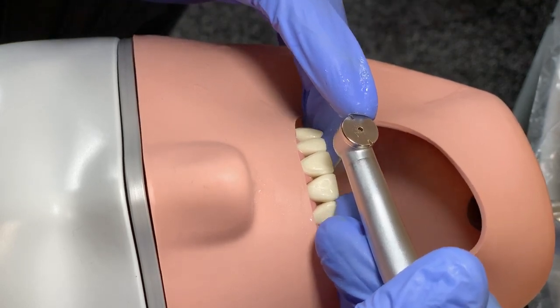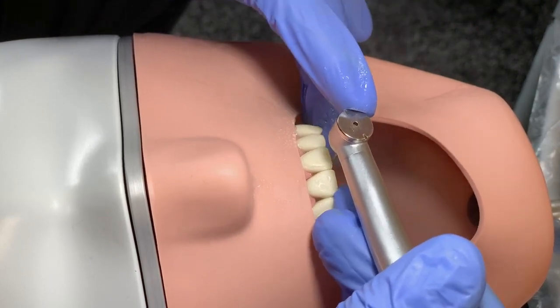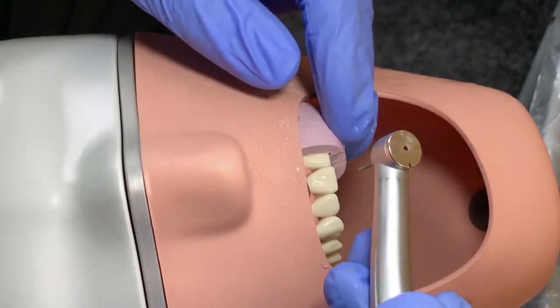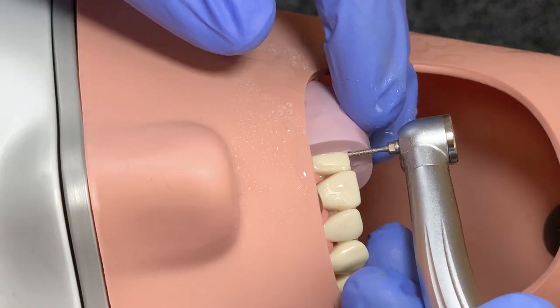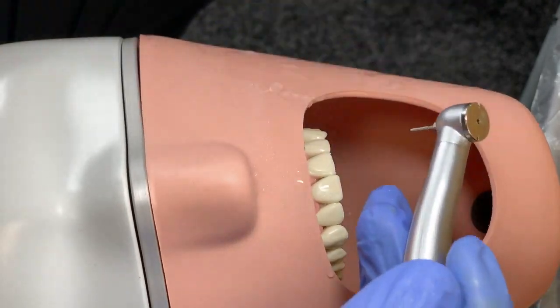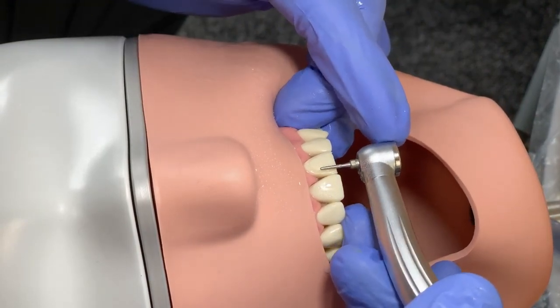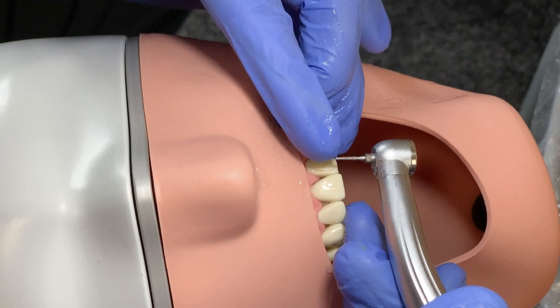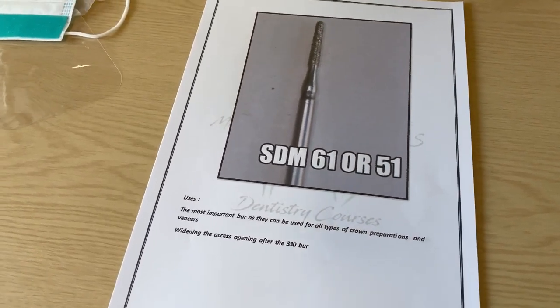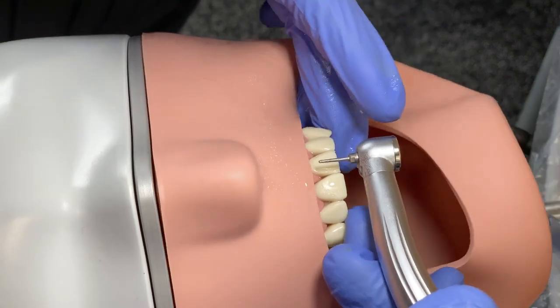This is how I hold my handpiece — this will help you to have 100% control. I will check with my putty to see if it is 1 mm or less than 1 mm, just to give me more control about my reduction. Now we are going to start the buccal reduction. This is your bur, and as we need to remember, we are using the SDM bur — I will show you a picture of this bur. I like this bur and always use it in most of the exercises.